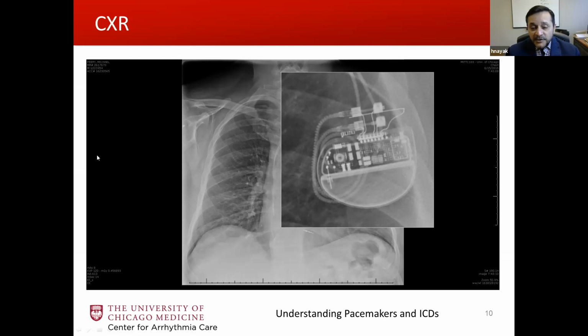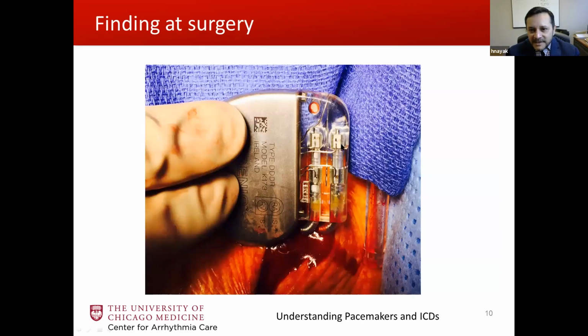So with this person, we talk about a loose set screw. That's certainly one possibility. Or in this case, the pin was just not pushed in past the distal set screw, back in 2011. The interesting part of this case is that the patient had really no syncope until about 5 years later. Remember, he didn't feel just right after pacemaker implant. There could have been some sort of make or break connection involving this pin header confluence. And of course, at the time of generator exploration, you can see the pin going through in the atrial lead, and this is missing in the ventricular lead.